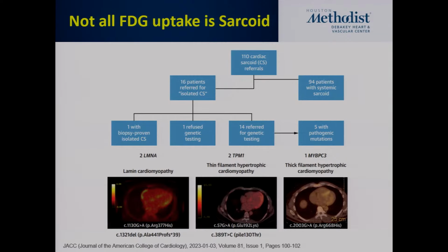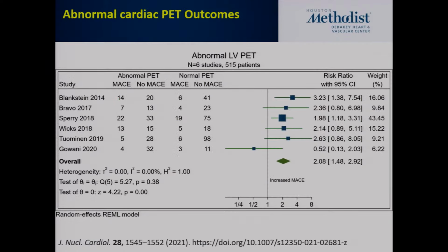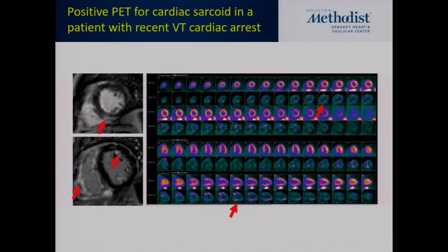It's just cardiac inflammation. Similar to the prognostic data that you heard from Dr. Shah, we're starting to see growing evidence from PET that the more FDG uptake you see, the worse it is. We also did a meta-analysis of that, and now we even have data for all-cause mortality and MACE. We also have data that even if you see RV uptake, that's also prognostic, and this is work that Ahmed published a couple years ago.